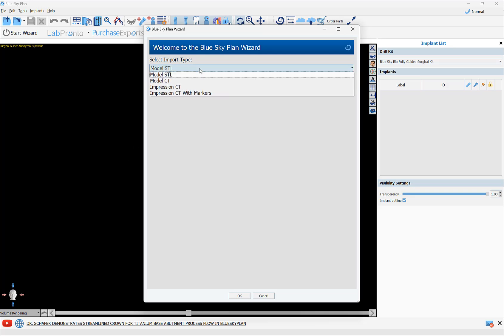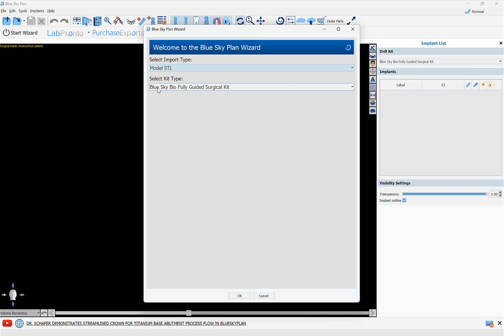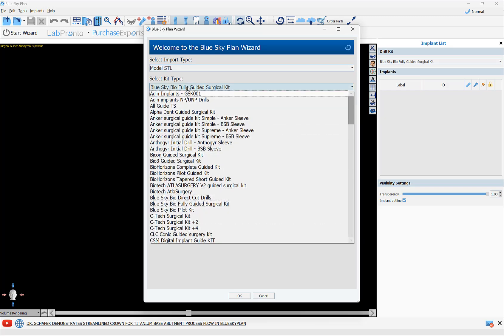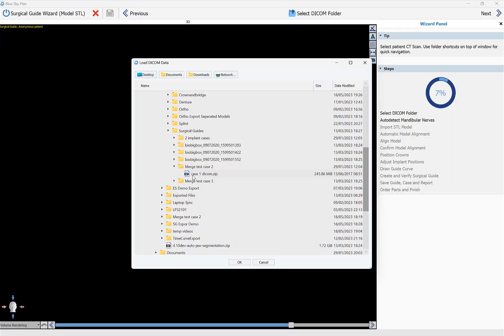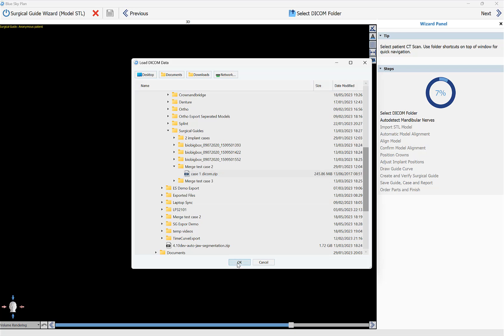The import type should be Model STL for a one implant case, and of course we recommend the use of the Blue Sky Bio fully guided surgical kit. We do have more than 70 different implant systems in Blue Sky Plan, so if you are using a different implant system, select the relevant surgical kit for that system. Once you've done that, click OK. We're going to select the CT scan — with Blue Sky Plan you could load compressed or uncompressed DICOM, zipped or unzipped — select the relevant folder or file and click OK.